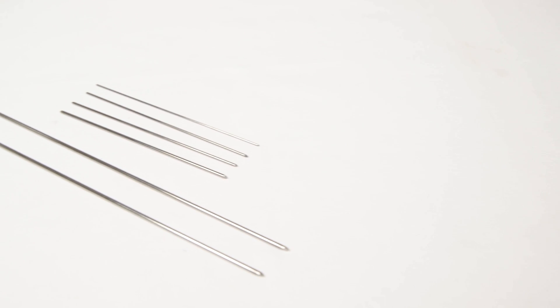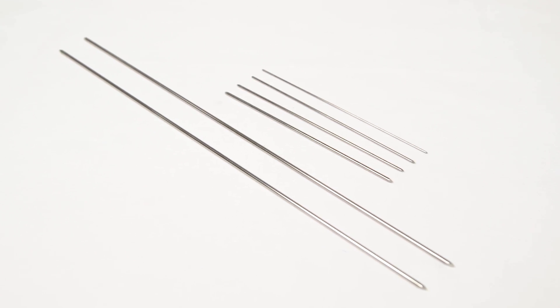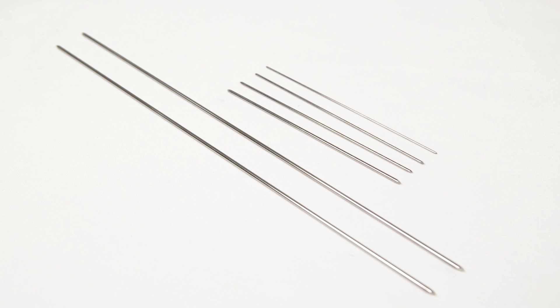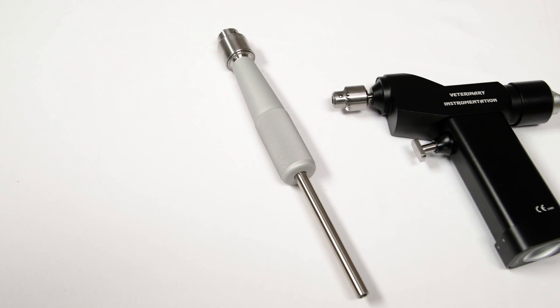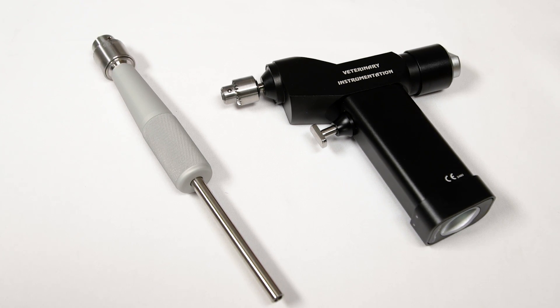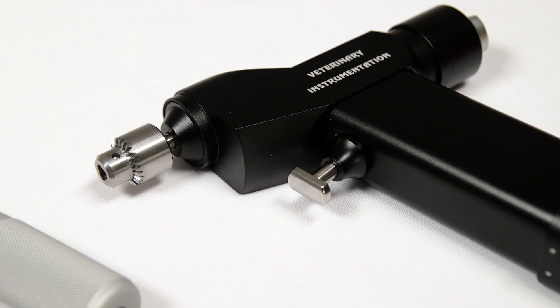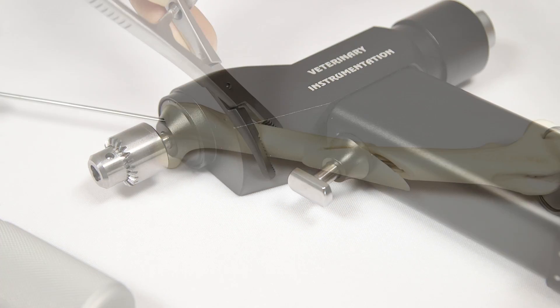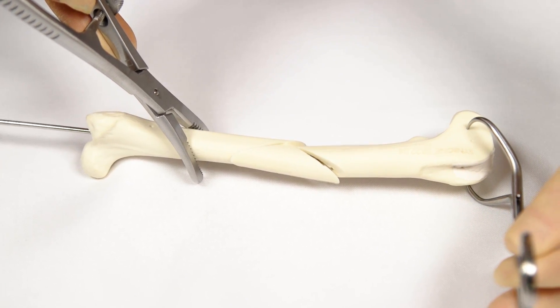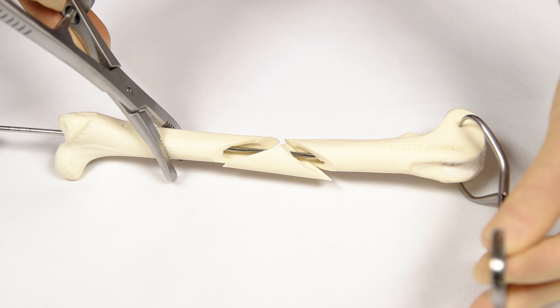In small patients where the required pin size is less than 2mm, an arthrodesis wire can be used instead of a Steinmann intramedullary pin. A Jacob's chuck, powered drill, or wire driver is required for insertion of the IM pin — powered insertion is preferred for accuracy of pin position and direction. The intramedullary pin is placed first to restore limb length and alignment and to hold the bone segments in position for application of the ESF.